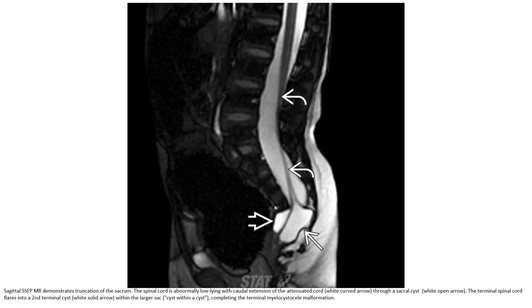Of the sacrum. In this case, the spinal cord is abnormally low-lying with caudal extension of the attenuated cord through a sacral dysraphism. The terminal spinal cord reaches into the sac of the terminal myelocystocele, which is on the right side, completing the terminal myelocystocele malformation.